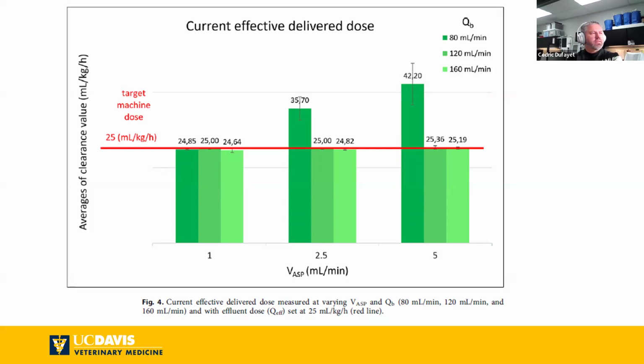So I don't think it's that much that application that I'm interested in that medicine. But I was thinking pretty regularly when I'm starting a treatment, and maybe my dialysate flow is higher than I would like compared to my blood flow, I like to measure a saturation ratio. So the ratio between my effluent BUN and my BUN of blood entering the hemofilter to know if I exactly get 1 ml of clearance per ml of effluent or if I need to apply a correction factor. And definitely when I do that, aspiration velocity could have an impact. And I'm definitely going to look at that a little bit differently.